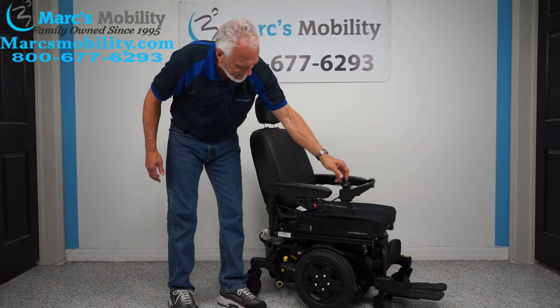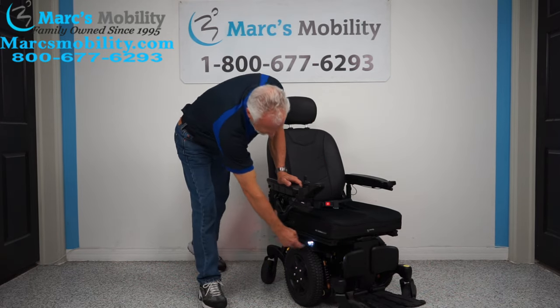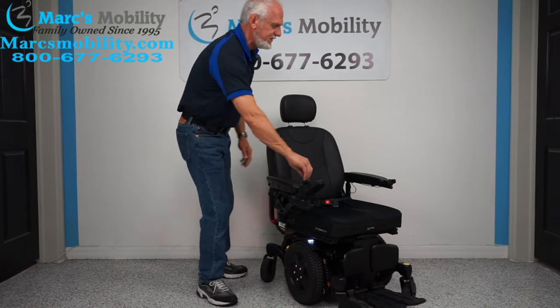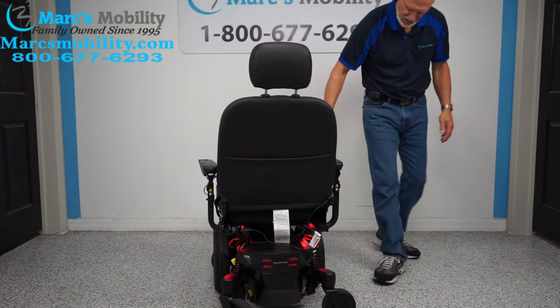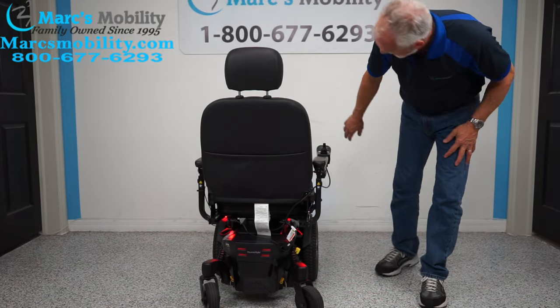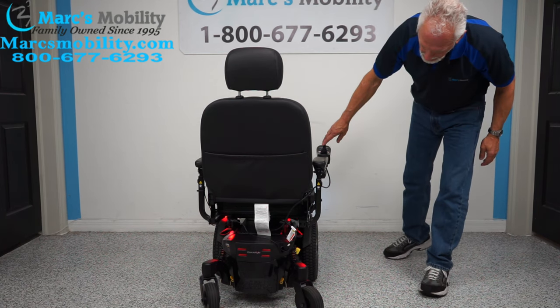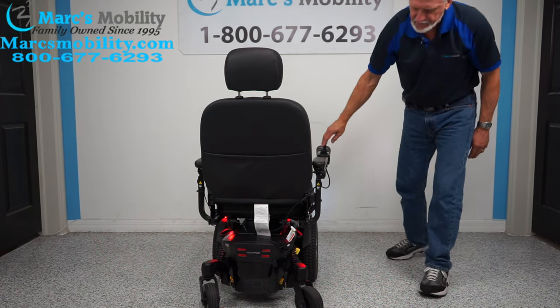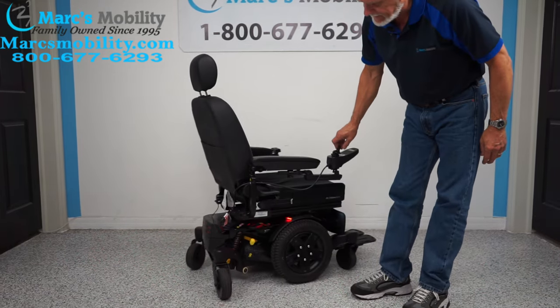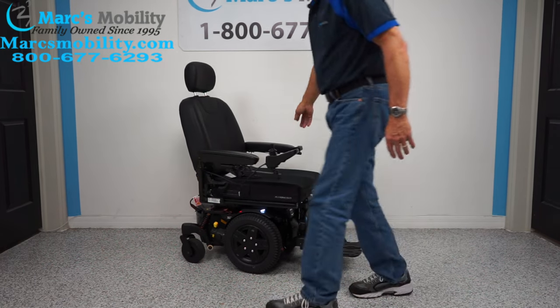This chair is equipped with headlights and taillights. There's a little switch here — if I hit it, you can see the headlights and you can see the taillights. I'm not saying you can go down the highway with those lights, but you can definitely go down your hallway at home at nighttime in a dark house — it'll light up your whole room. You have the rear lights and the front lights on this chair. These are factory lights.